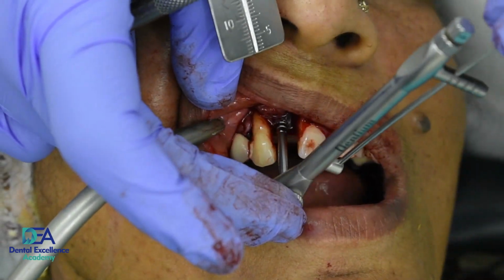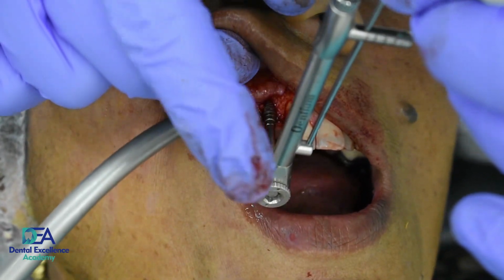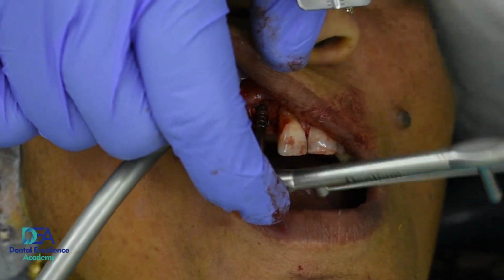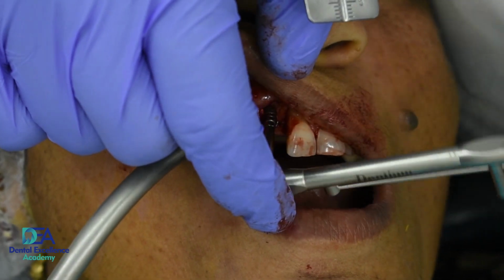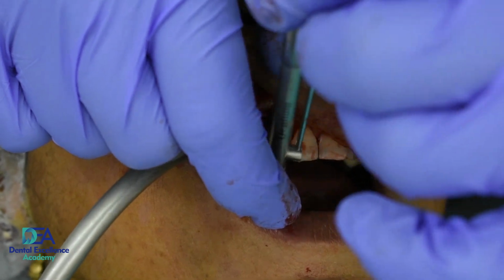Now you can see I'm using a torque wrench and I'm getting almost 35 to 40 torque in this region. It is very difficult to get so much torque in the anterior region, but we have a good amount of bone.